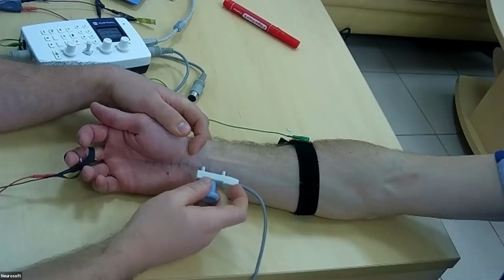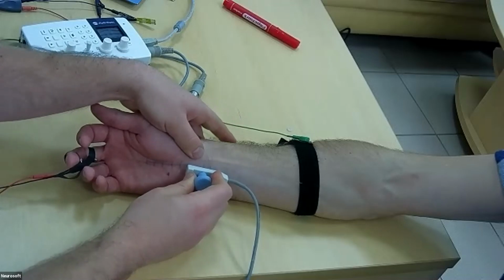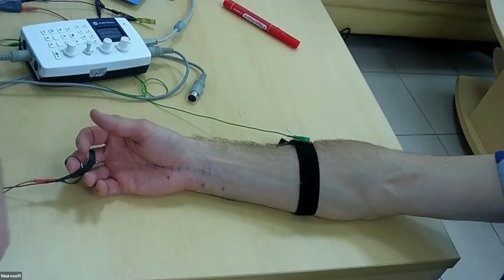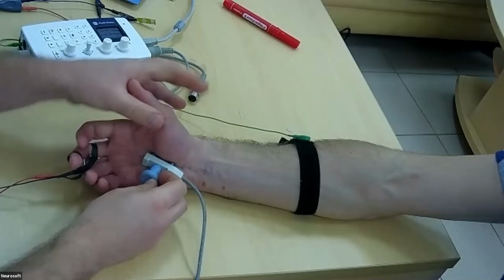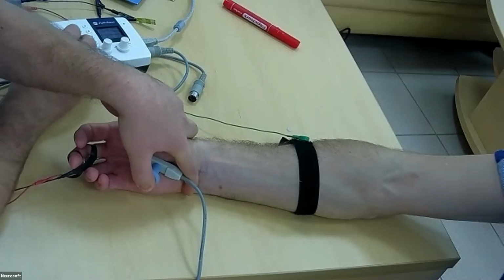Here it is for the carpal tunnel, for the median nerve sensory inching. So we start stimulation most distal. Usually it's about half of the palm. We start stimulation.